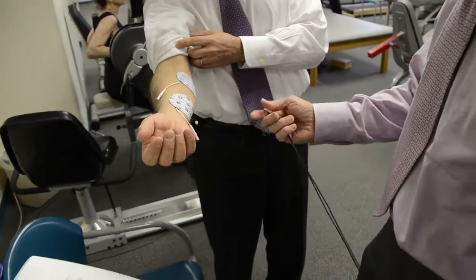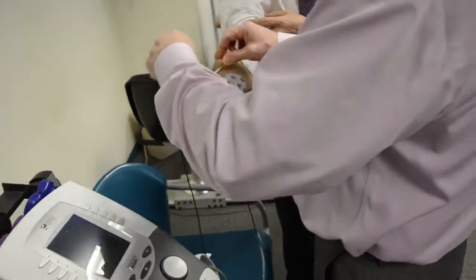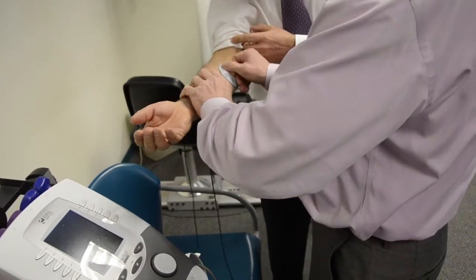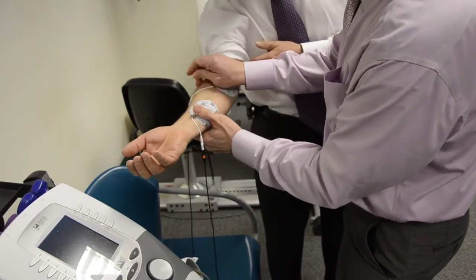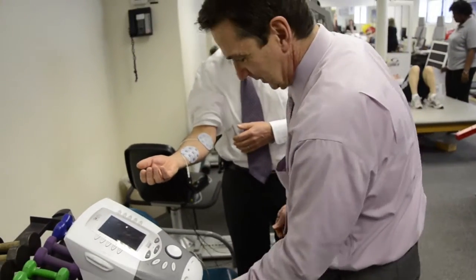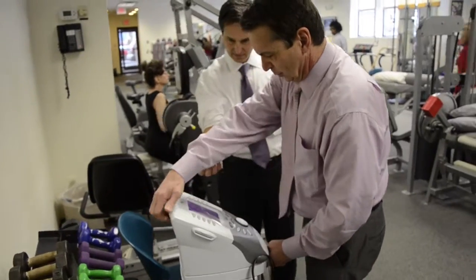So you realize if you electrocute me, this will be a viral YouTube. There's fun stuff we could do — really good for our ratings. I could teach you about the physics of electricity using this. I like learning about the physics of electricity without electrodes on my arm. You know about current density? I'll show you the trick I did with the kids — my son used to love this. He used to have this portable unit.